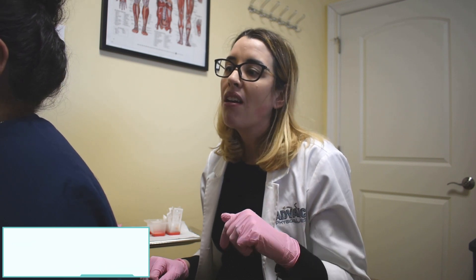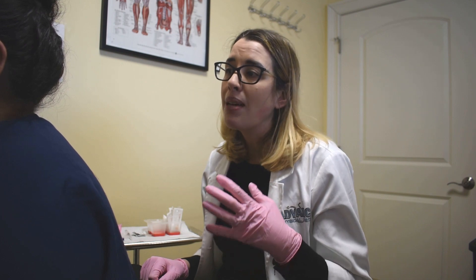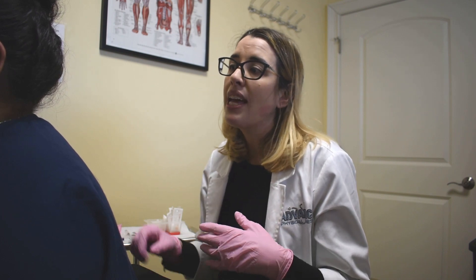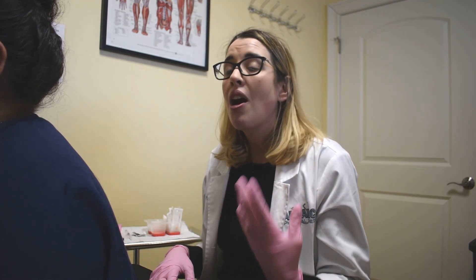Hi everyone, Alyssa Barnes here, a nurse practitioner with Advanced Physical Medicine. I'm going to be doing an occipital nerve block for this patient today. This patient's been complaining of migraine type headaches that start at the base of her skull and radiate up over the back of her skull to behind one eye. This is a very common condition that we treat here.